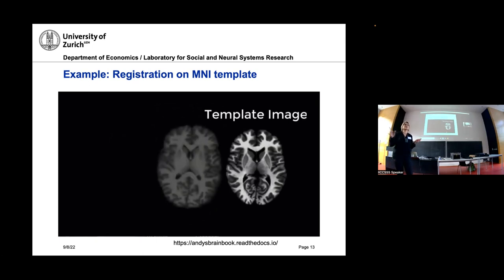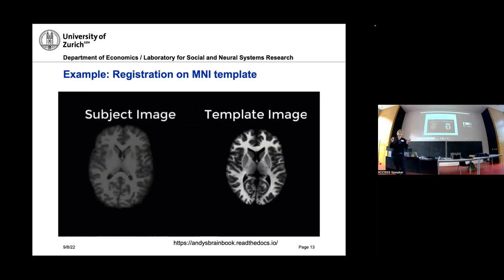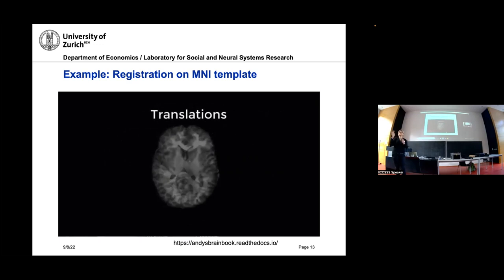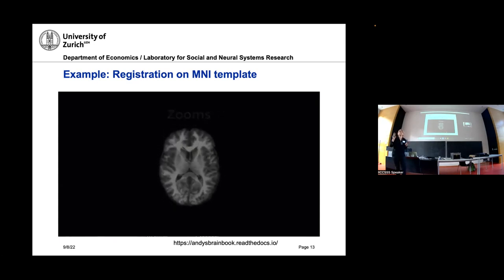Yes, to some extent. When you check for the motion within the fMRI data, this can be done at the same time as you extract the brain from the T1 data, right? So this doesn't matter. But for bringing them together, you only want to bring the fMRI data to the T1 data after you've done the motion correction. And there are some other small steps like slice timing. I did not mention it here because it's very detailed, and there you also have to take into account the order.